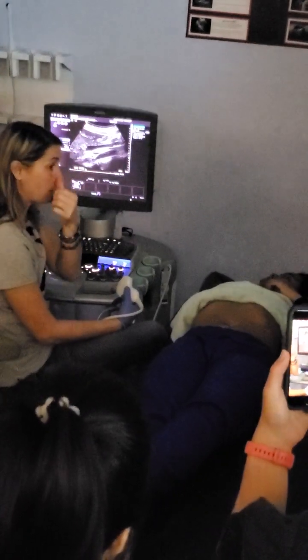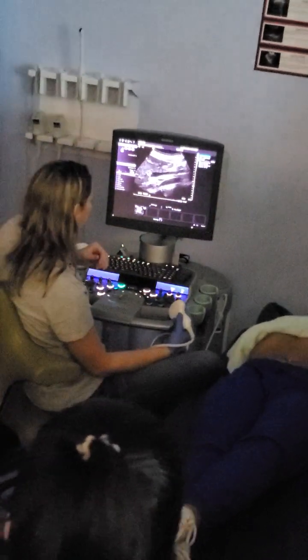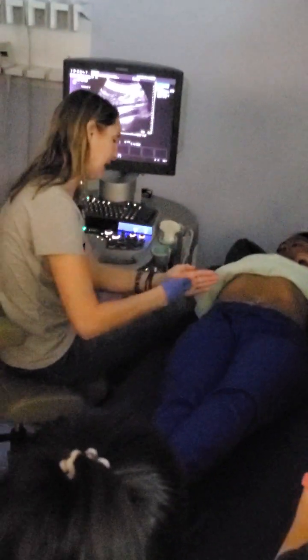Any questions on that bad boy? The orientation? Yep. Okay. So this is in her body like this. We've got splenic vein to portal splenic confluence to main portal vein coming into her liver. And we've got SMV, IMV coming in.